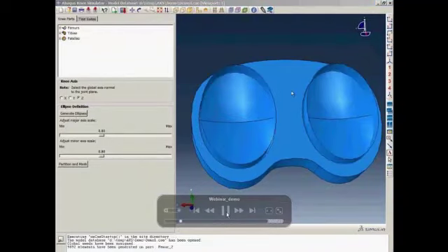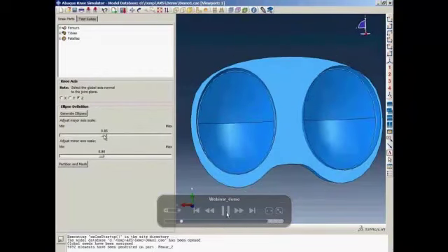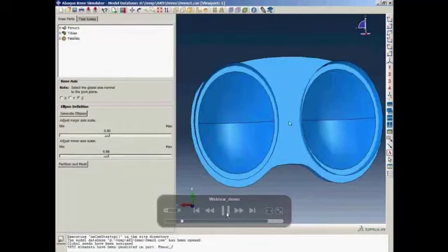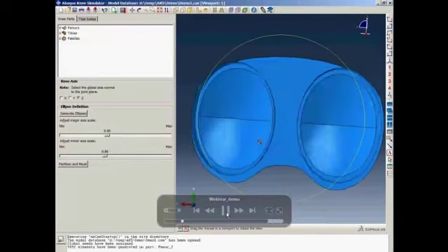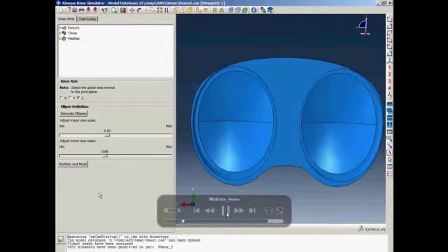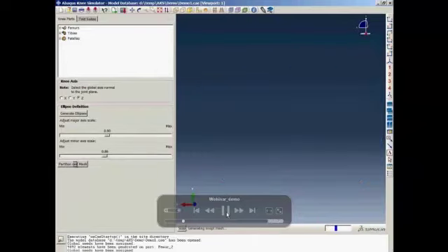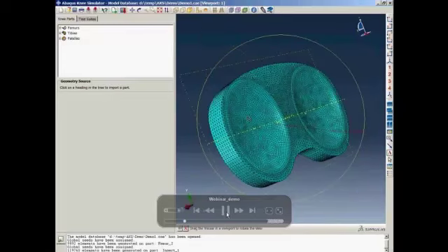Now you can see the ellipses are generated, and we provide the tools to control the minor and major axes of these ellipses. The idea is to have the ellipses as big as possible to cover all potential contact area, but at the same time to avoid any interference with the external edges of the implant. Next is partition and mesh. A mixed mesh will be generated automatically with hexahedral mesh in the contact area and tetrahedral mesh for the rest.